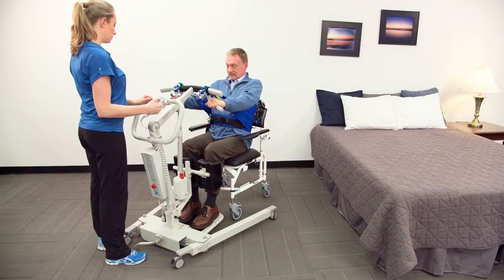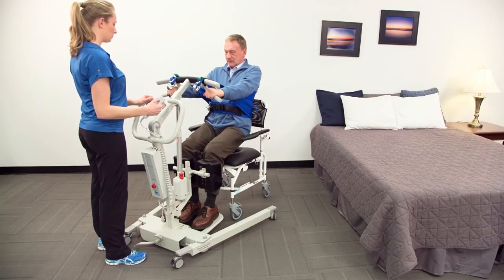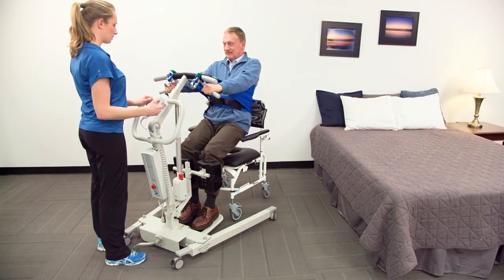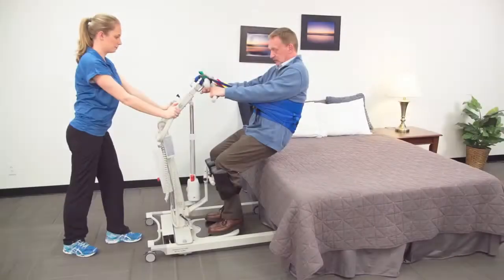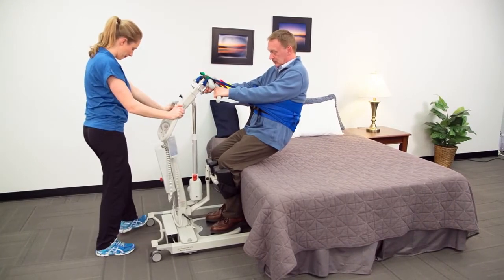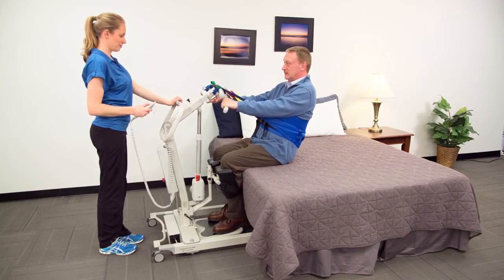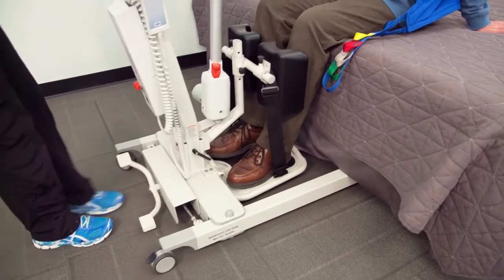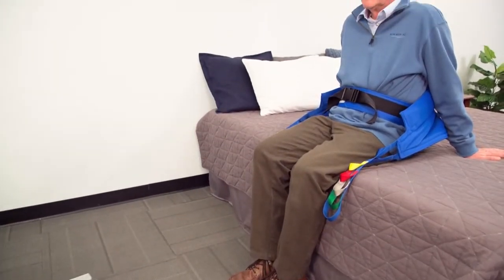Stand Assist devices, like all ergonomic and mobility aids, are designed to prevent caregiver injury and to make patient transfers and lifting easier, safer, and more comfortable for the patient. Some advantages of Stand Assist devices are they are simple and safe to use, do not require any track system, and can be easily rolled about to access care areas where a ceiling lift system is not available.